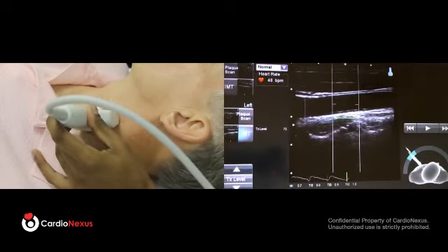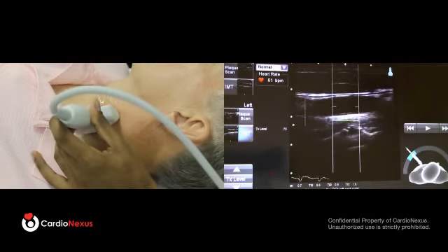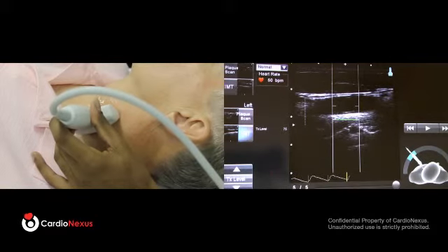Autofreeze will occur much quicker, and you're able to locate on the left side or right side of the screen where the widening of the artery is. This is more for reproducibility and future review of the reports. You can quickly see where you were located on the artery when the measurement was made. Whereas if you have an oblique view of the vessel, although you may know you were in the correct spot, on future review, it's unclear as to how high or low on the vessel you were.